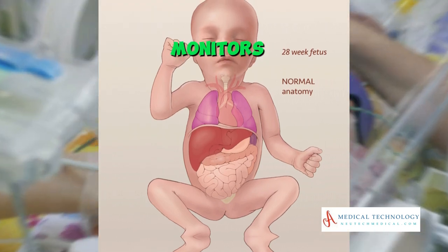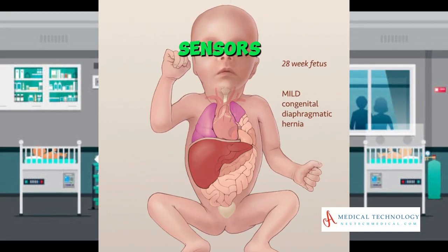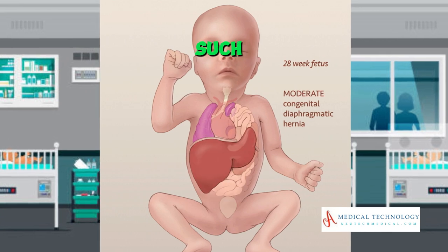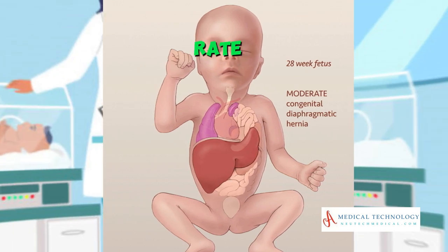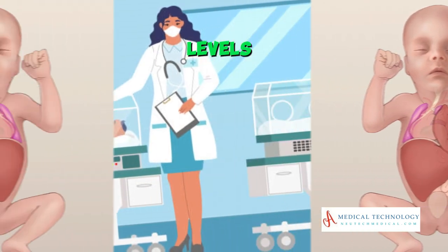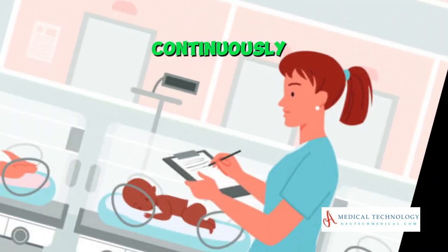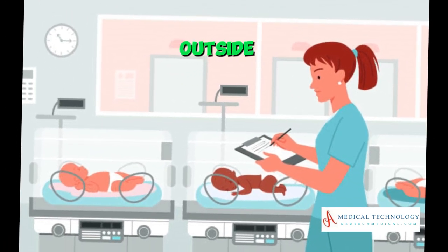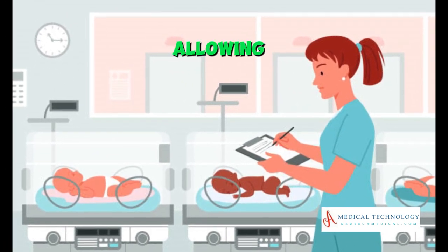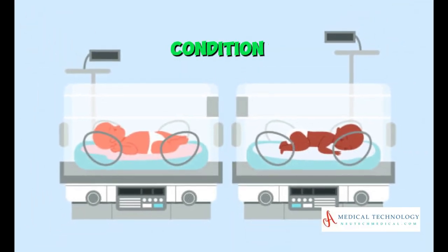Monitoring system — sensors and monitors. The incubator is fitted with sensors to monitor vital signs such as heart rate, breathing rate, and oxygen saturation levels. These sensors continuously transmit data to monitors outside the incubator, allowing healthcare providers to track the baby's condition.